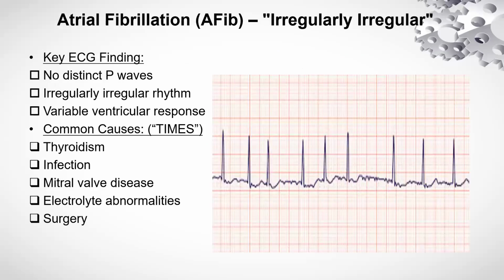All right, so atrial fibrillation. My God, time is going fast. And in atrial fibrillation, you see that it's irregularly irregular. Look, no distinct P waves. Can you see any P waves here? Anybody, can you see a distinct P wave here? No, sir. So there's no P wave here, isn't it?